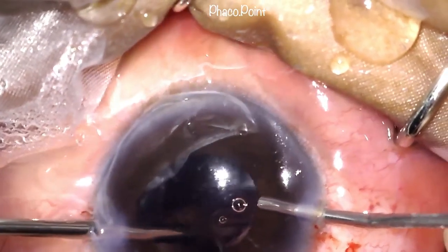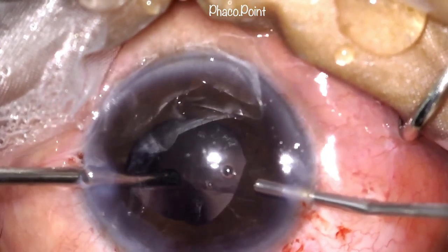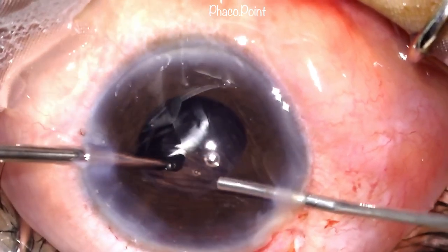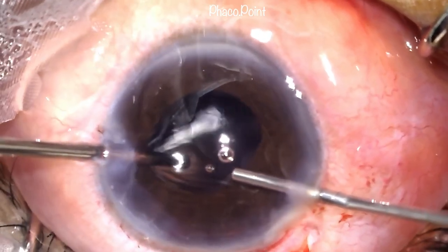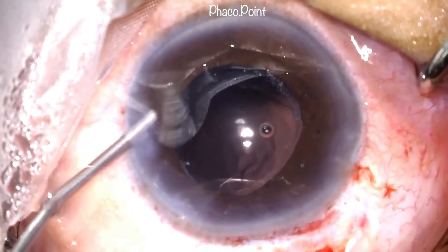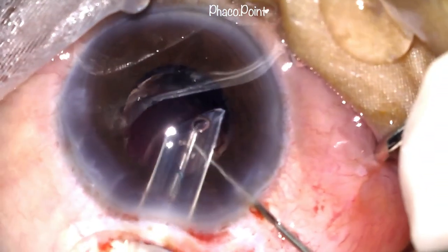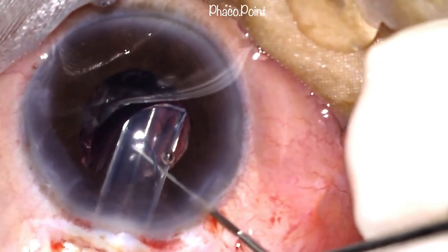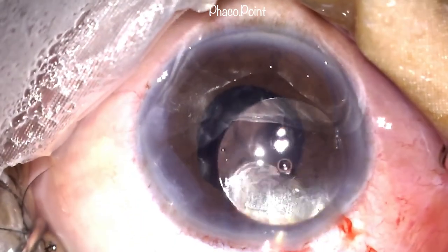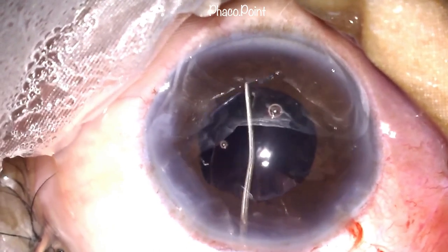A check anterior vitrectomy is then once more performed to ensure that the removal of the IOL did not result in any further vitreous disturbance. Having completed this, a three-piece IOL is now injected and placed securely within the ciliary sulcus. Note how each of the haptics is dialed into the ciliary sulcus.